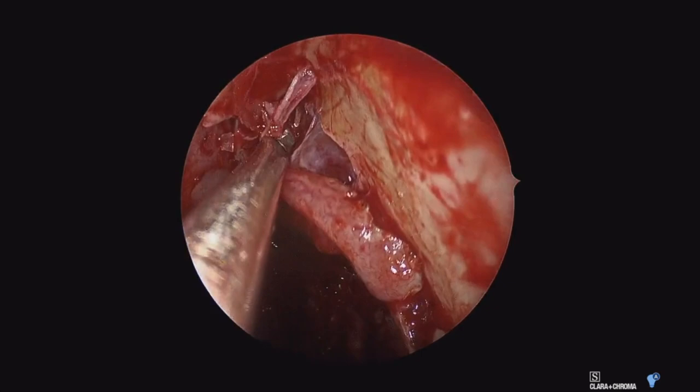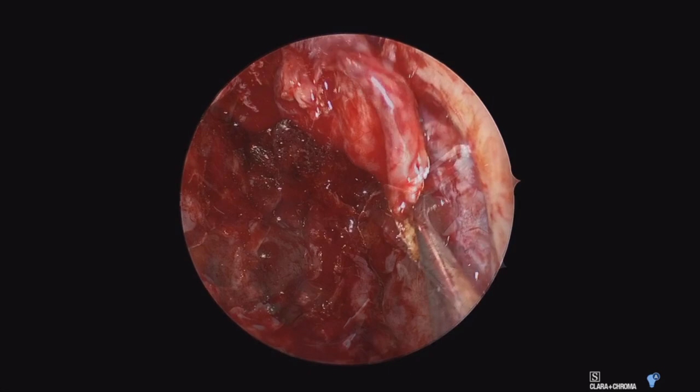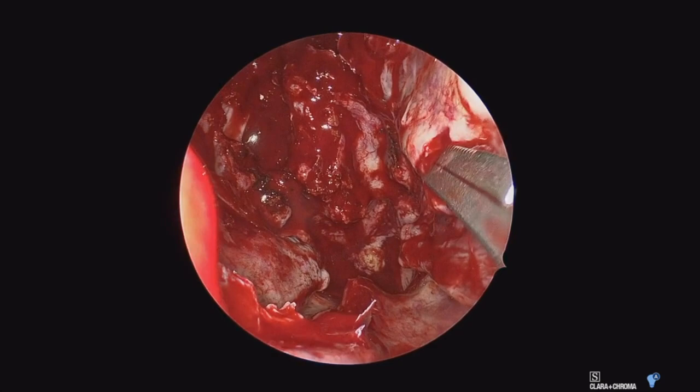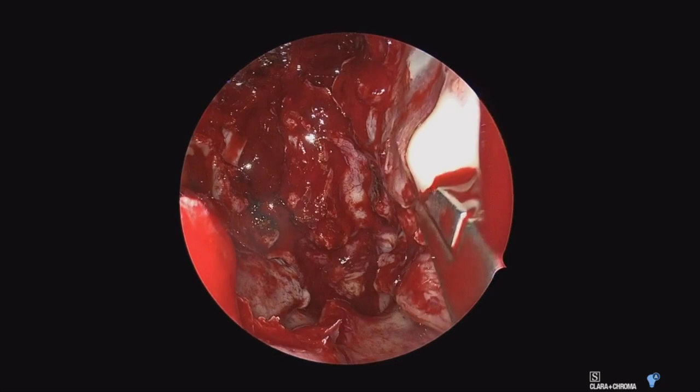Now here we are working on the lateral nasal wall. We're over the nasal lacrimal duct in this particular shot. We have already taken margins anteriorly and are peeling all the soft tissue off of that area. I'll go ahead and complete a maxillary antrostomy to open the ethmoids on this side as well.